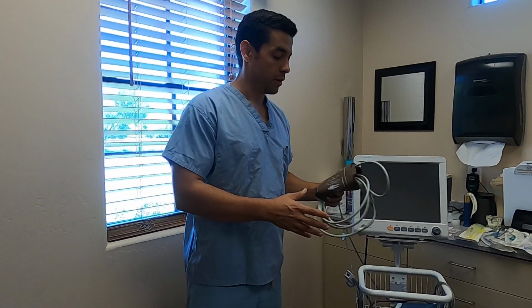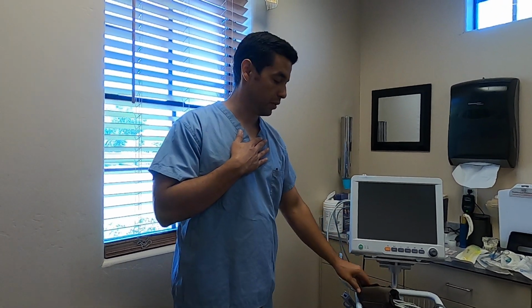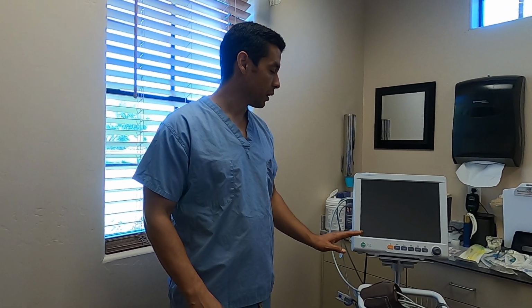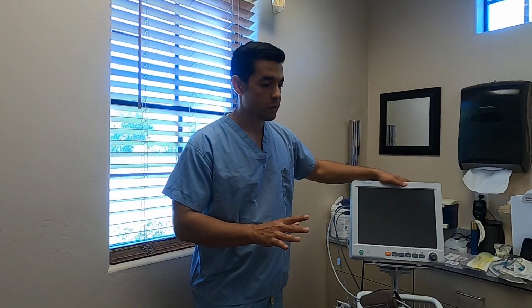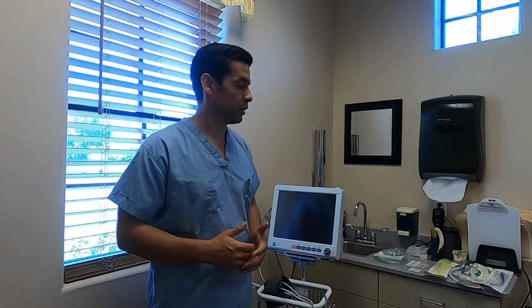So start with the blood pressure cuff. You can proceed with the leads for the EKG, put the pulse oximeter on, and we can leave the nasal cannula off until a little bit later on. But those are important. We want to get a blood pressure so that we can see that it's appropriate for the procedure, that it's not going to stop our procedure from moving forward. Once we have the monitor on and we've seen the vitals and they seem to be appropriate, then we can move on to the consent form.